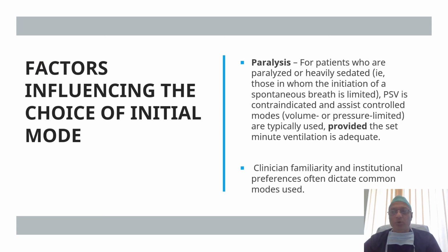For patients who are heavily sedated or paralyzed, pressure support ventilation is contraindicated and assist control modes are typically used. Another factor which influences the choice of the initial mode is clinician familiarity and institutional preference.